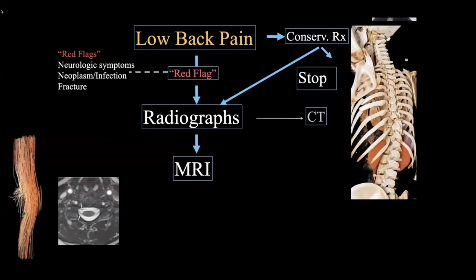And I'm going to actually be using this quite heavily later on in the talk when it comes to looking at the anatomy, because this really allows us to see some of the anatomic details better than we would see on traditional radiographic evaluation. So look out for that. That isn't available everywhere, but that is something that I think will become more and more a part and parcel of everyday practice. And then, of course, we have options like bone scans, pretty good for looking for systemic issues.